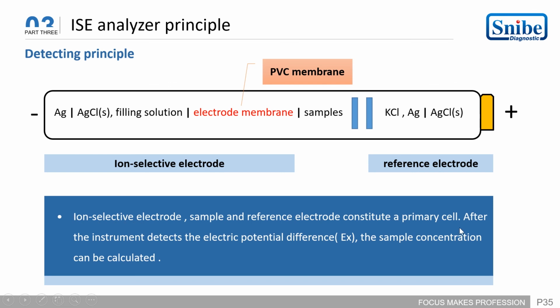After the instrument detects the electric potential difference, Ex, the sample concentration can be calculated.